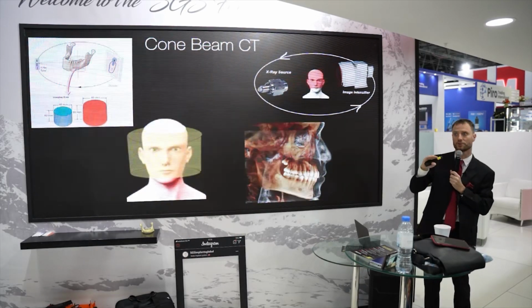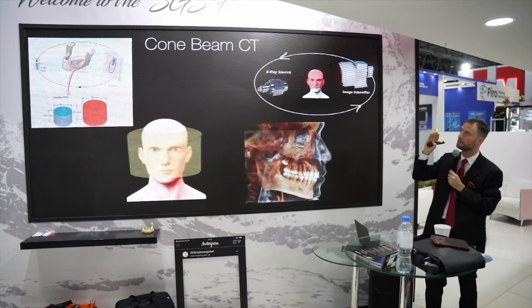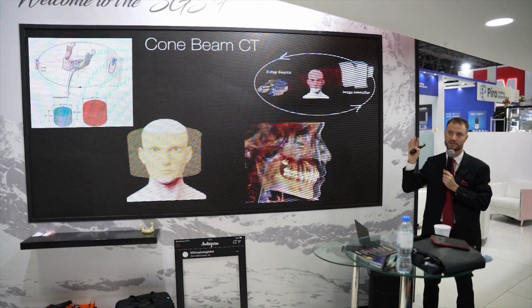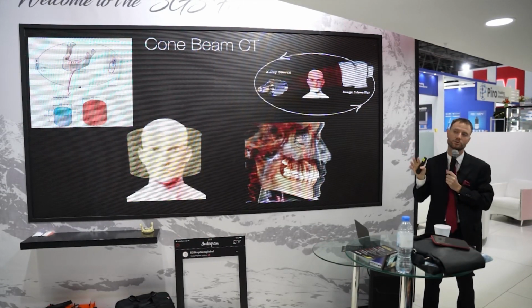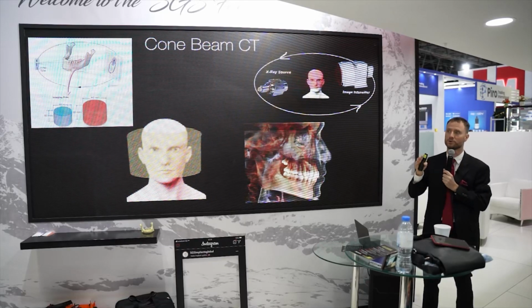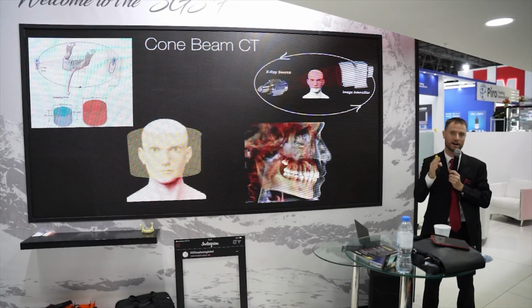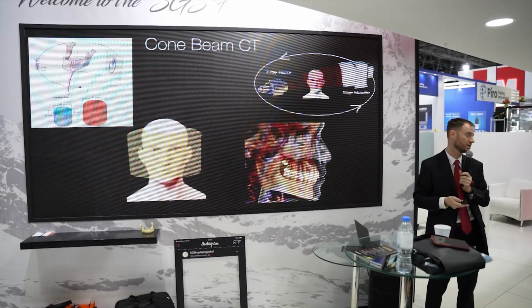It's important for you to understand how the data flow, the digital flow of this is, because the field of view is a critical factor of this. I've seen a lot of X-rays working, CBCT units, and most of them are not really used properly. You need to understand what you are interested in, how you can get the best resolution with the least dose of radiation for the patient.